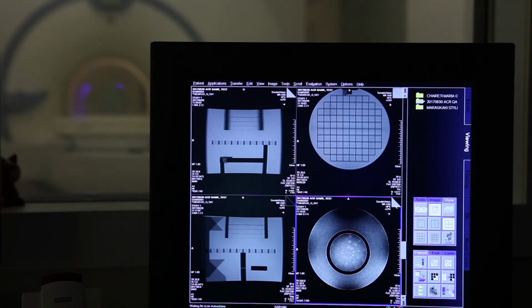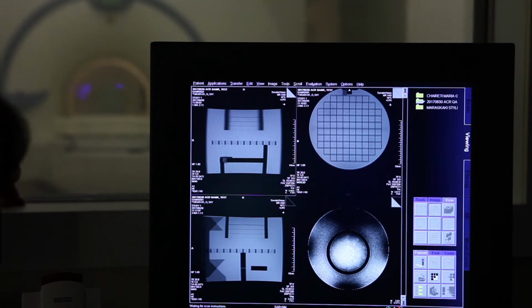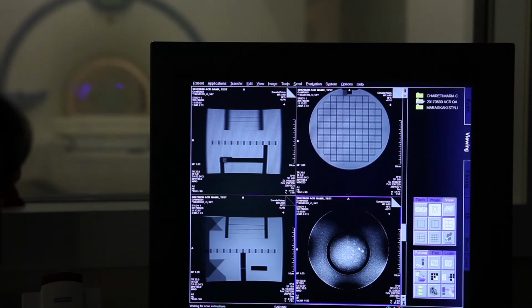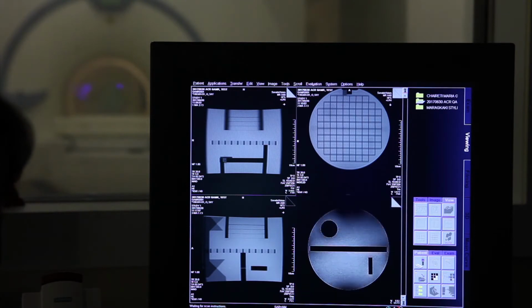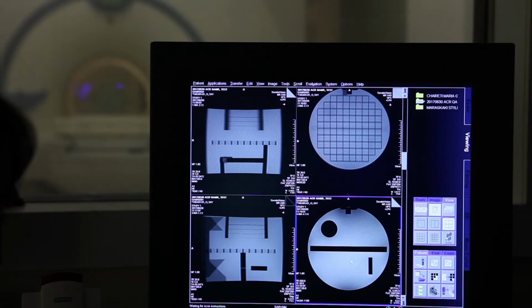And the second one is the same sequence like the previous one. We open the sequence, we copy all the parameters, right? So you again go to localizers at the center, and you see everything is okay. We copy the position from this sequence to the other. This is a T1 sequence, spin echo T1. This is a double echo, which is a proton density and T2 weighted sequence.